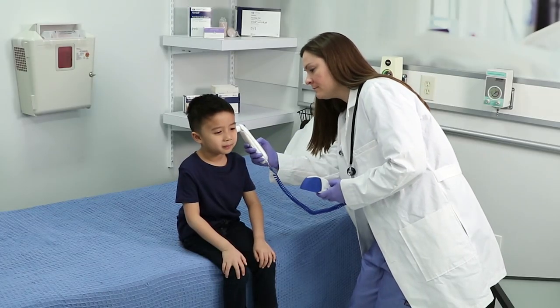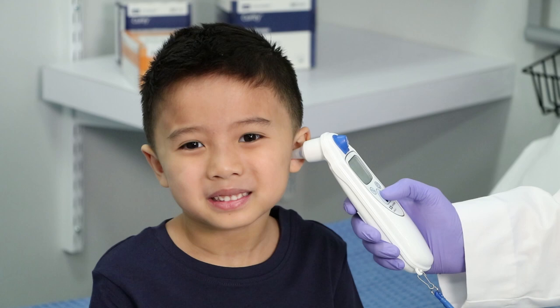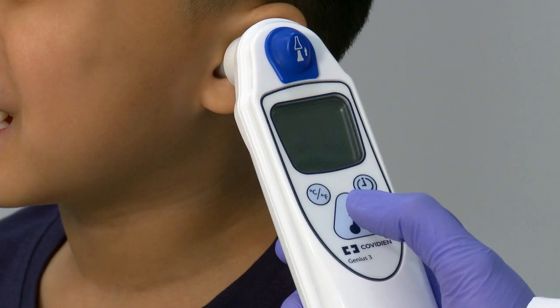Place the probe tip in the ear canal and lightly seal the opening with the probe tip. Ensure the probe shaft is aligned with the ear canal and keep the thermometer straight. Once the probe tip is properly positioned in the ear canal, press and release the scan button.